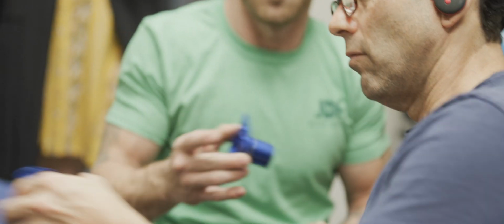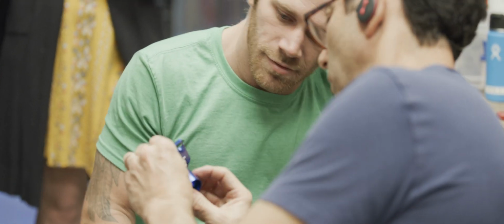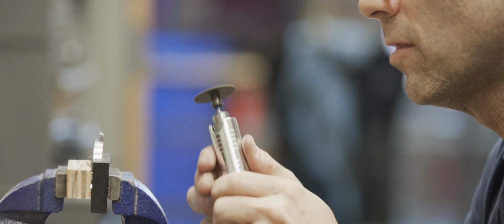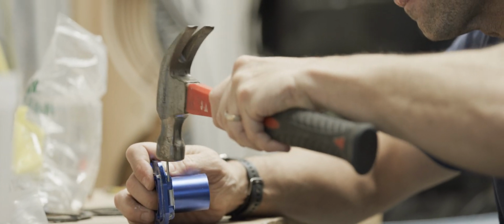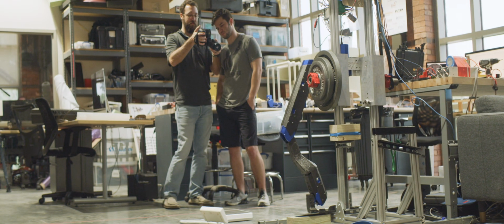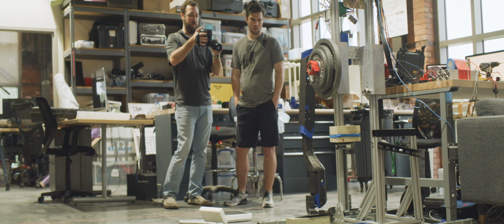And we also had a few small issues with our motor locks. So when designing a component via CAD, it's always expected that when you begin to manufacture it and begin to see what processes you're going to use to make the components, you're going to have a little bit of tolerance errors. And you'll have to understand your processes and work through that to make sure you can get all of your components to fit properly.